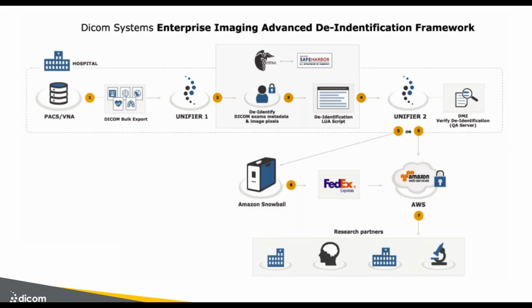I'll walk you through the steps of the entire framework which we provided to HSS. And so it begins with their PACS, their VNA, their archives, and they went ahead and identified relevant studies that they wanted to de-identify for consumption by the research company. And so they did a bulk export.